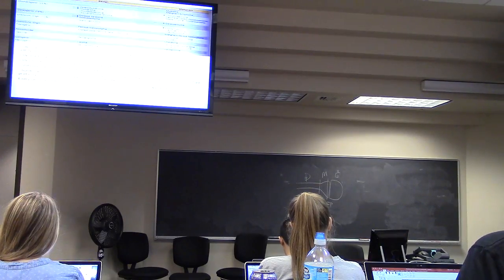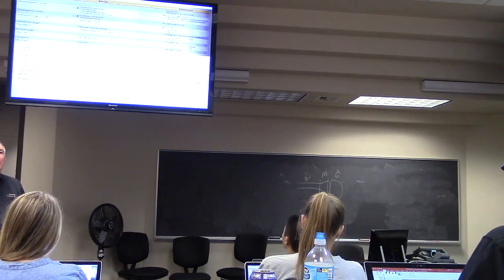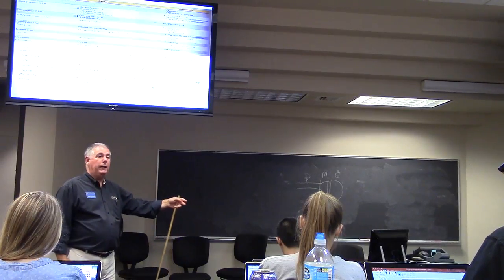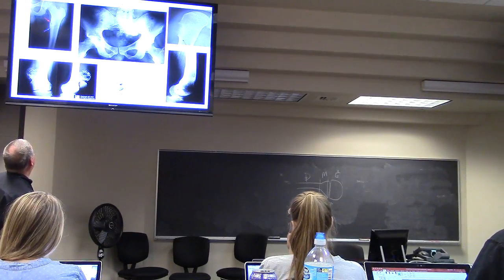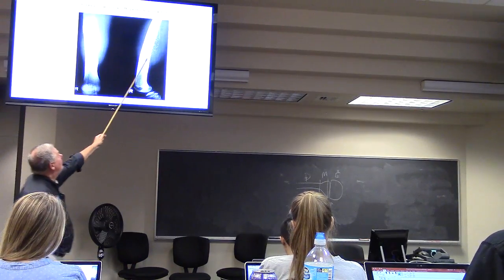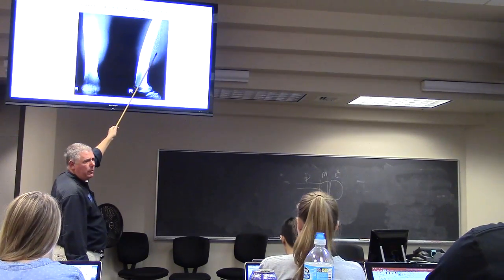This is not a classic bony tumor or cartilage tumor. It actually has the appearance more of lymphoid tissue, related to that mesenchymal line, not the connective tissue line. Okay, I don't think I have a Ewing's in here. Now, oh, here it is right here. This is the Ewing's sarcoma here. It's not a radio-opaque tumor.